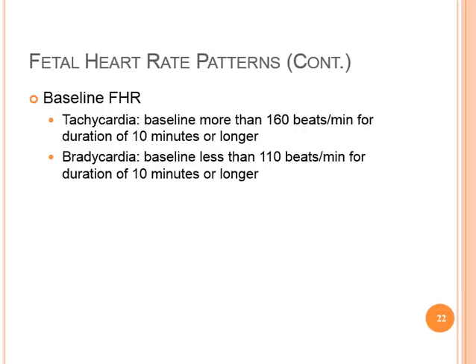The clinical significance of the bradycardia depends on the underlying cause and accompanying fetal heart rate patterns, including variability and the presence of accelerations or decelerations. And again, Table 15-3 lists causes, clinical significance, and nursing interventions for fetal bradycardia.